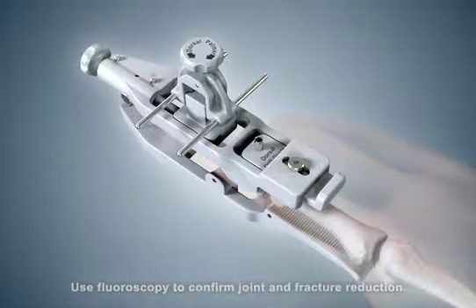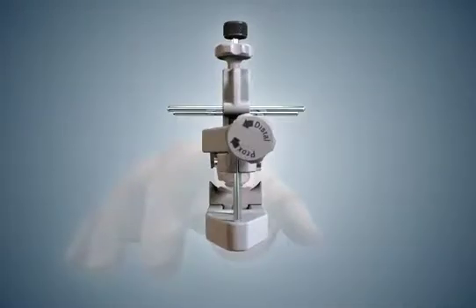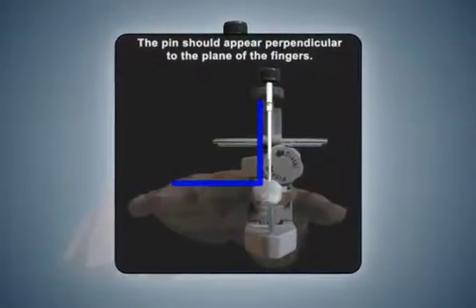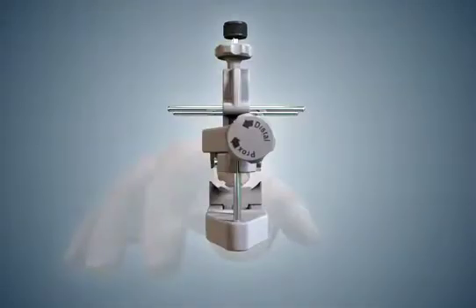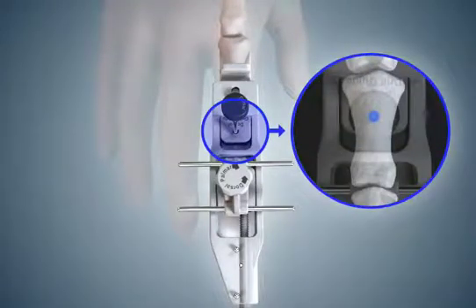To confirm correct rotational positioning on the finger, select the dorsal pin and place it into the dorsal drill guide. Then check the orientation of the pin placement guide on the finger by looking at it from the distal end of the guide. The pin should appear perpendicular to the plane of the fingers. Next, ensure the pin will be placed on the midline of the middle phalanx. Check the position of the drill guide on the finger from the top of the hand. The pin should be centered on the width of the middle phalanx.